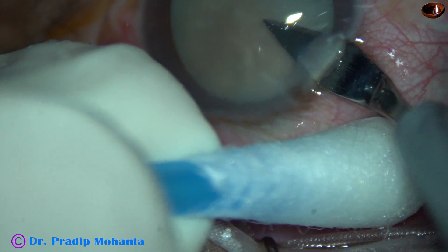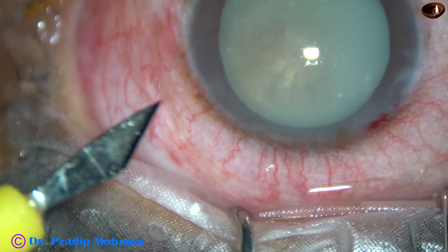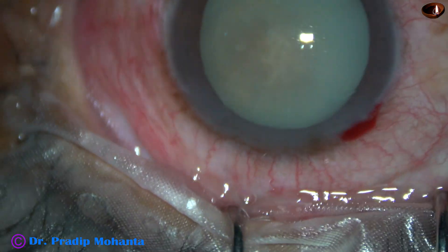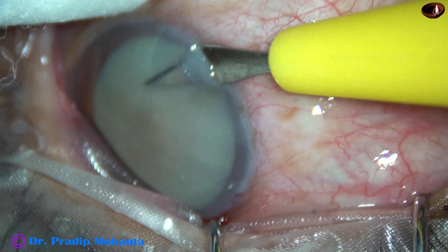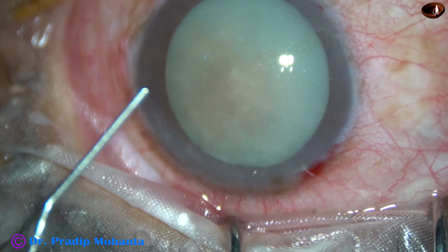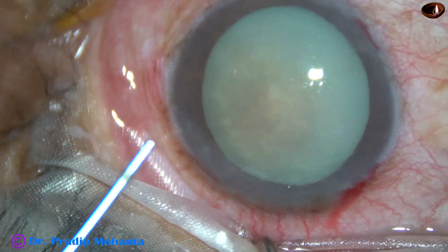This is the main incision with a 2.8 millimeter steel keratome. This is a side port on the left side of the main incision, and now one more side port is being made on the right side of the main incision. The side ports are about two and a half to three clock hours away from the main incision.